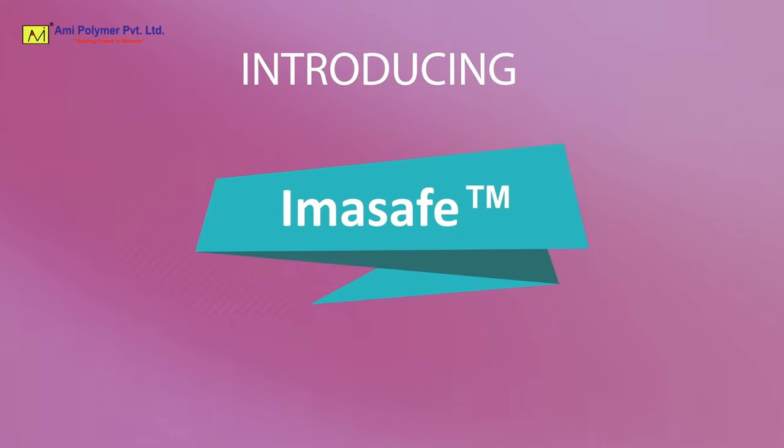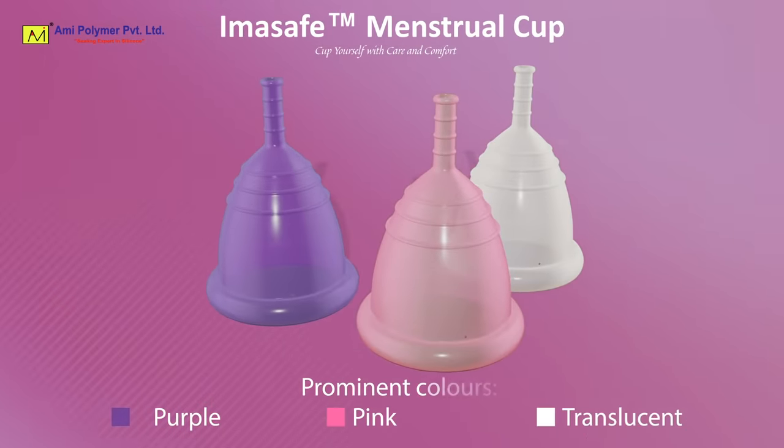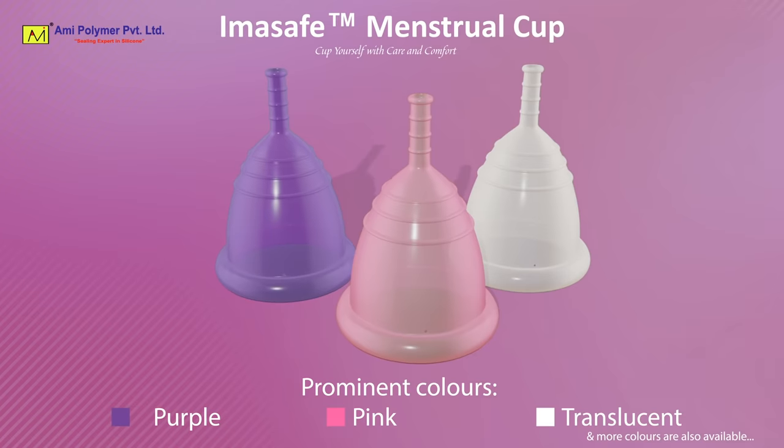Introducing ImaSafe. We, Ami Polymer, are an eminent manufacturer of the ImaSafe Menstrual Cup.